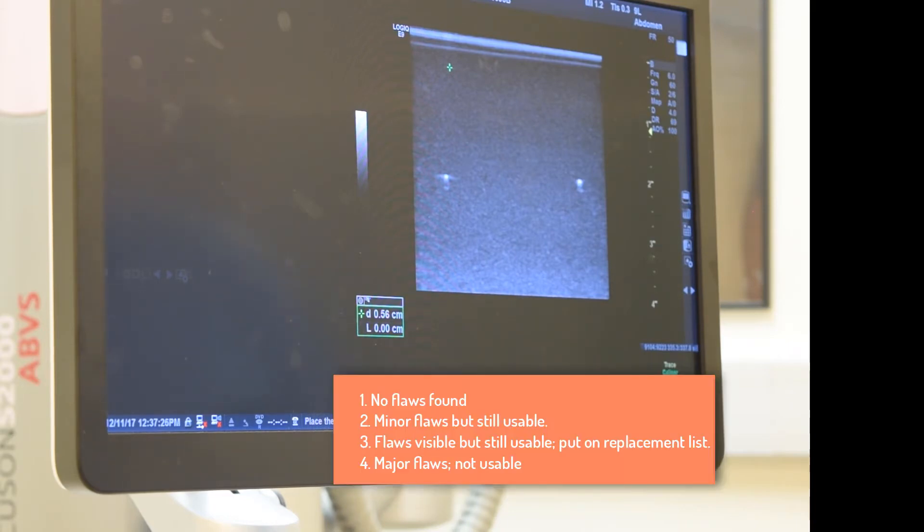We utilize a four-point rating scale when we evaluate our transducers. Number one, no flaws found. Number two, minor flaws, but the transducer is still usable. Three, flaws are visible but still the transducer is usable. And fourth, replace the transducer. In the image on the left, we have an example of a curvilinear array transducer where we see three different flaws emanating from the surface of the transducer.